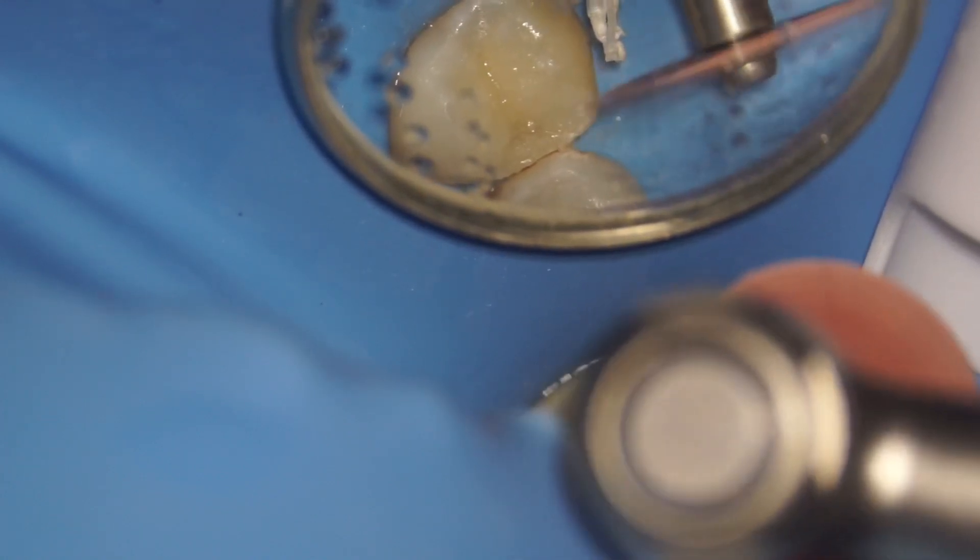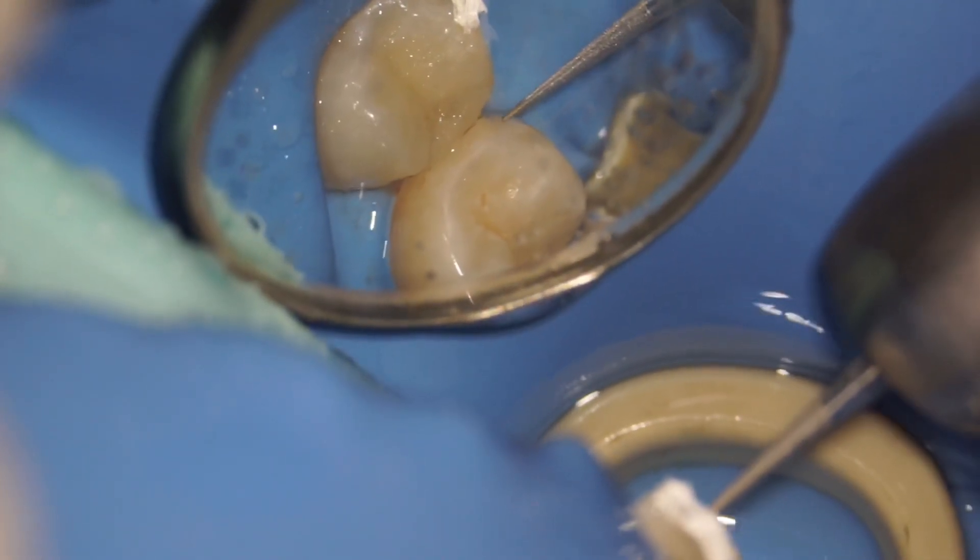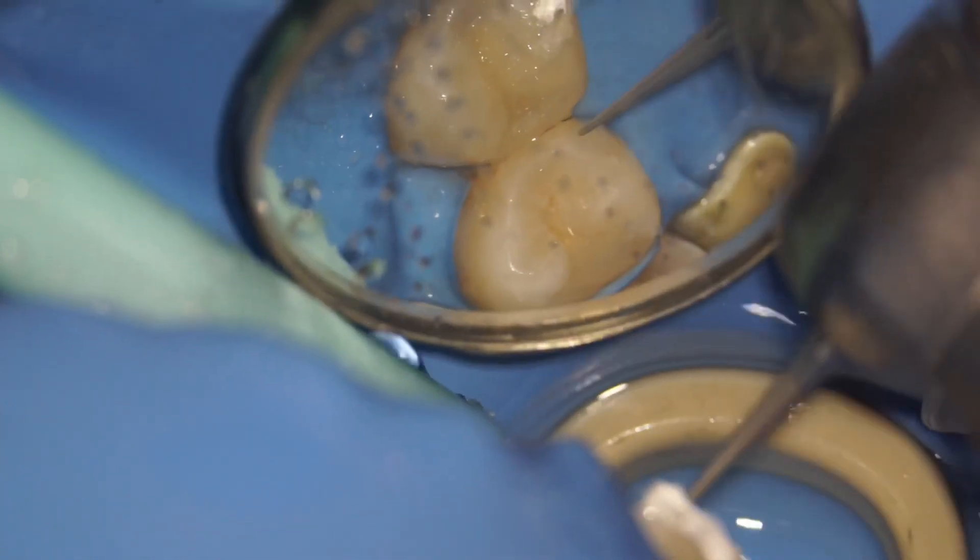I'm going to use a bur, but even with the bur I'm not getting a very nice curved-looking contact. So I'm going to use a Soflex disc. Soflex is a very good tool because it's not very fast-cutting and you have more control using it at slow speeds. Once you're done, use a scaler to remove any excess bonding agent, and then use a sharper yellow-grid diamond bur to remove any small excesses.